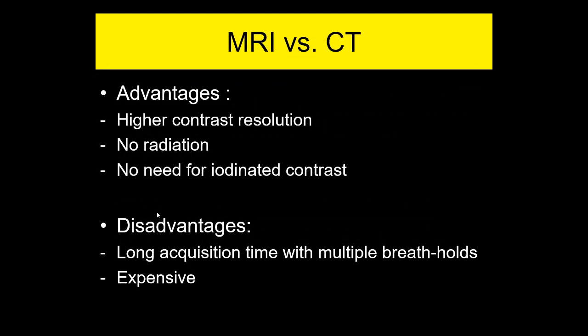And so what is the added value of MRI when compared to CT? Not just for osseous lesion, but for all lesions. And the reason to think about this in metastatic disease is that we have one PET MR and numerous PET CTs. And most people are not going to replace PET CT with PET MR. That's not really why you would get a machine that's 4 times or 5 times more expensive. The question is, what is the added value where PET MR may be able to replace a small portion of patients, instead of going to PET CT, you would rather get a PET MR. 20% of the cases as seen in the study before.